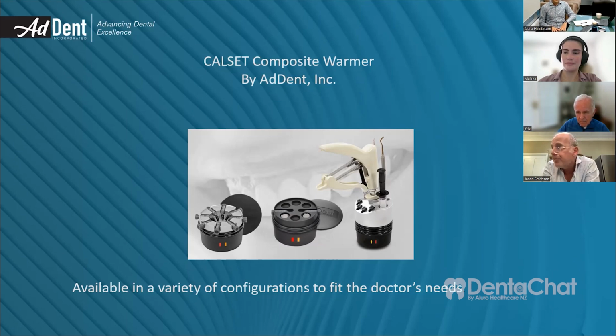I don't use it exactly for everything, but I use it at least 50% of the time. I use it when you want the physical and aesthetic properties of a packable composite, but you want the workability of a flowable. For example, I might use a packable composite in a very narrow class 2 box, where it can be quite difficult to get flowable in there without causing voids. There are some caveats in terms of how you cure it.